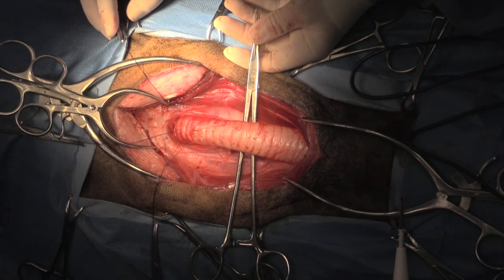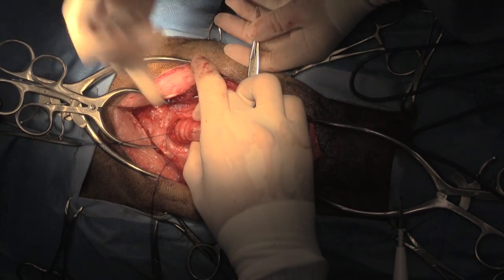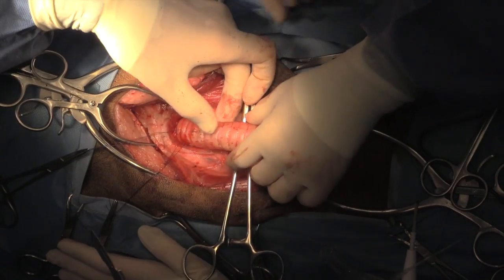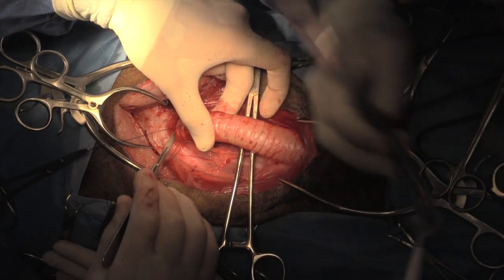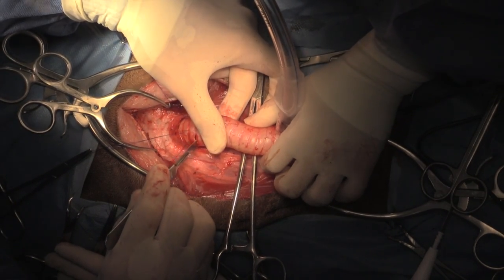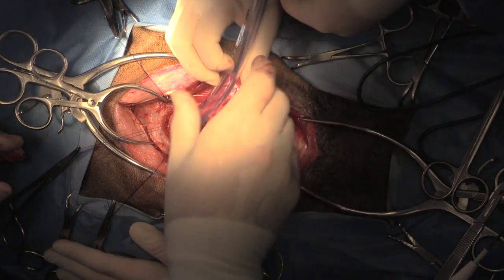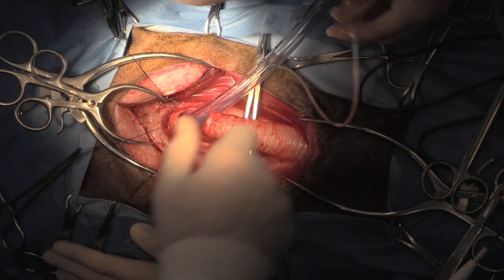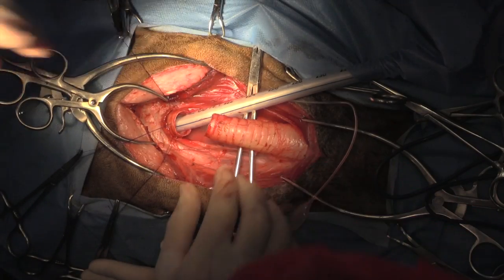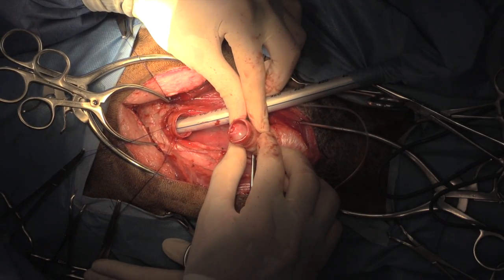Stay sutures were placed in the distal trachea to prevent the segment from retracting into the thoracic cavity after transection. The trachea was transected, a sterile endotracheal tube was passed down into the distal intrathoracic segment and the cuff was inflated. The tip of the tube was then passed under the drape and the anesthetic machine was connected.